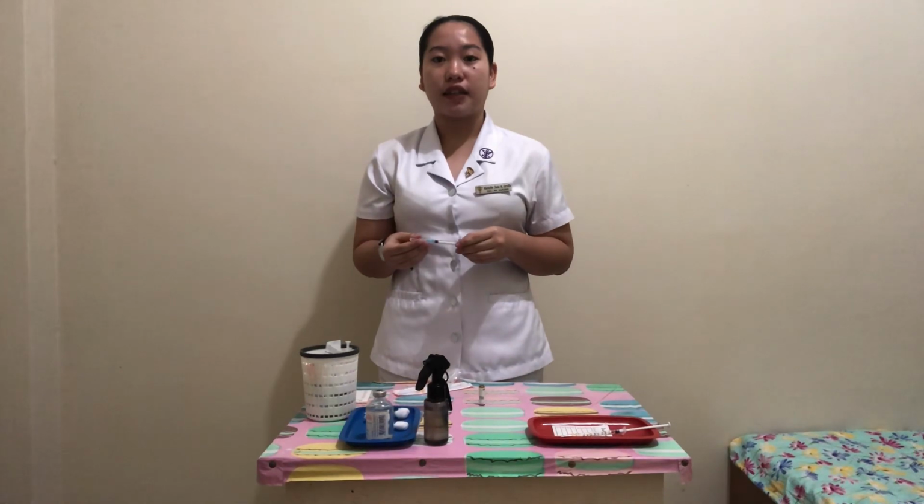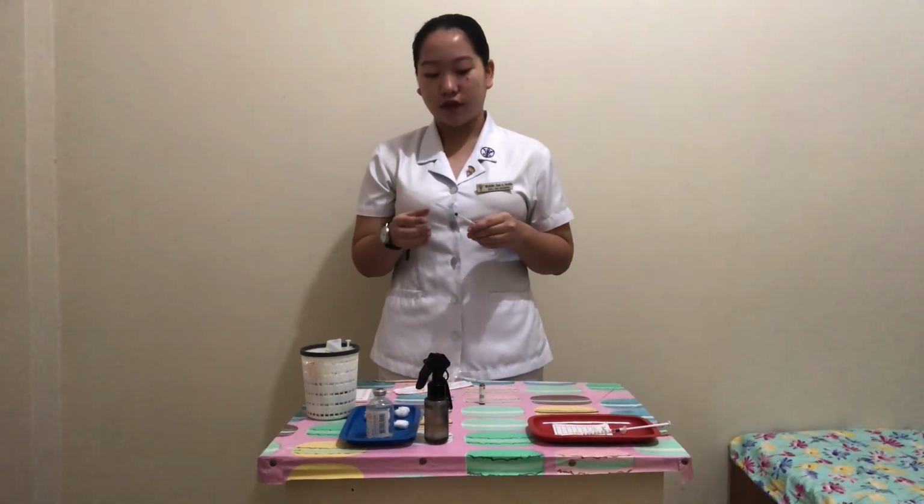So this time, we don't have to inject air inside the ampule, and also make sure that the ampule is on a steady flat surface, using your fingers to hold it.